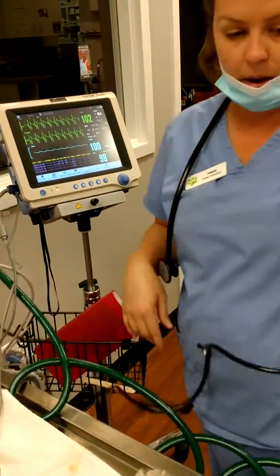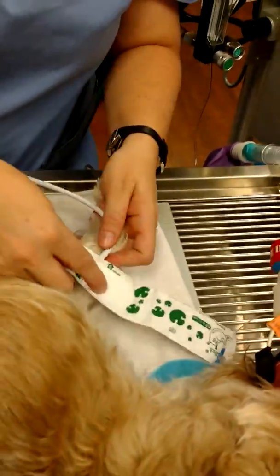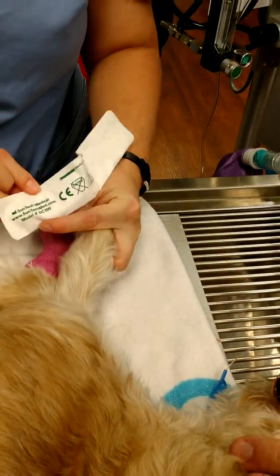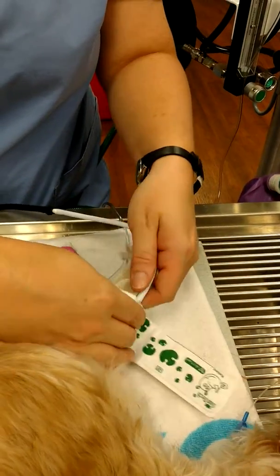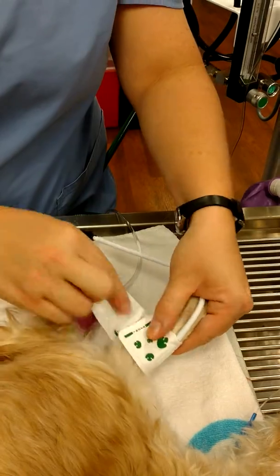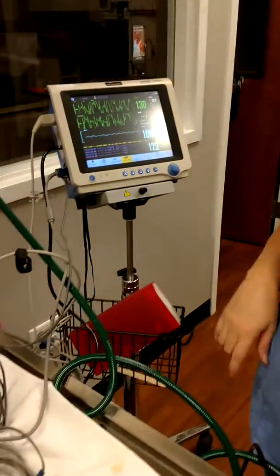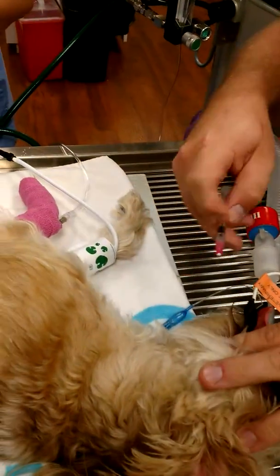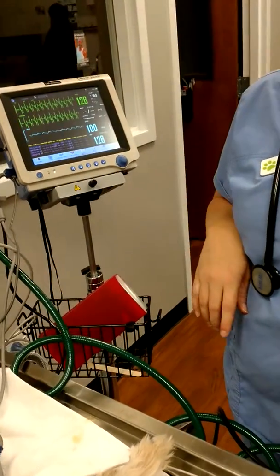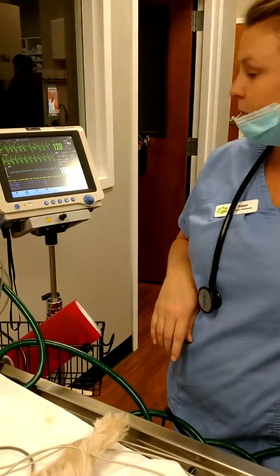Right now we're getting great numbers. So next we do the blood pressure cuff. Most of them are labeled 'this side to patient.' You want this side up, and the tubing needs to come over the cephalic vein. This one might be a little big for her, so we'll try it and press our blood pressure button. She's still a little light, as you can tell from her heart rate. We'll see what it tells us and if we need to go down a size in our cuff.